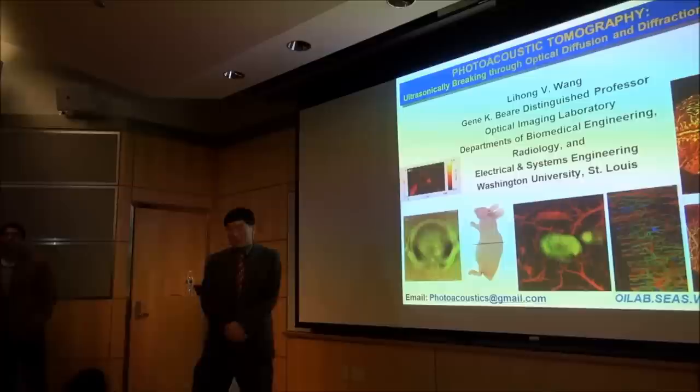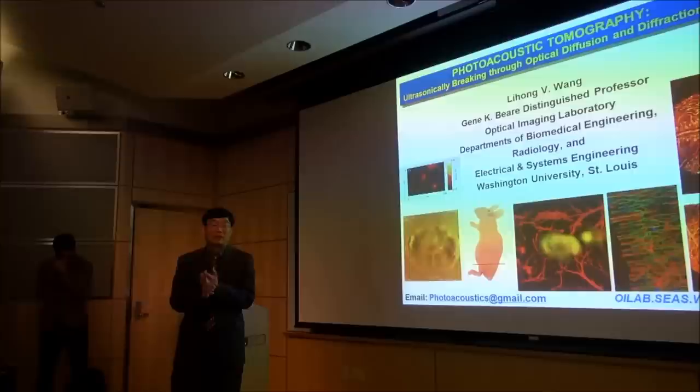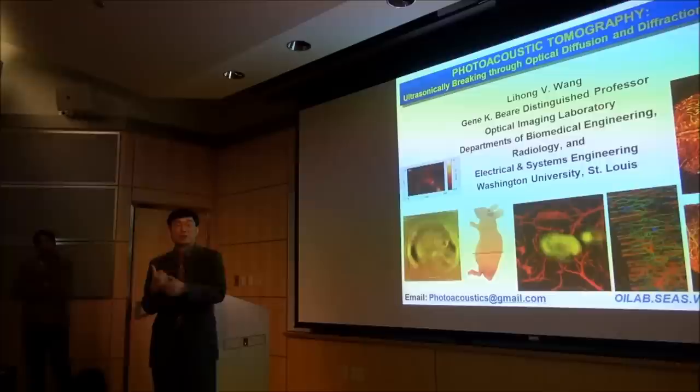Well, you look at light and sound, right? These are two forms of energy we're using. First of all, on the sound side, you typically generate millibars of pressure. That's orders of magnitude below the pulse echo ultrasound signal. With pulse echo ultrasound, you send bars of signal in and get millibars out, because the backscattering coefficient is really low. So the ultrasound is absolutely safe.